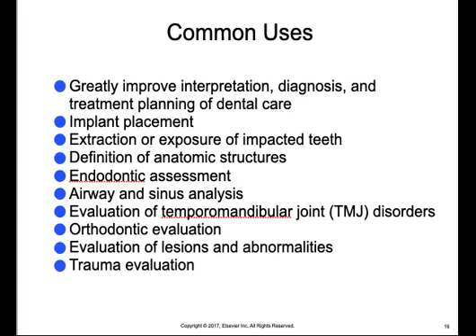Some other common uses include implant placement, extraction or exposure of impacted teeth, definition of anatomic structures, endodontic assessment, airway and sinus analysis, evaluation of TMJ disorders, orthodontic evaluation, evaluation of lesions and abnormalities, and trauma evaluation.